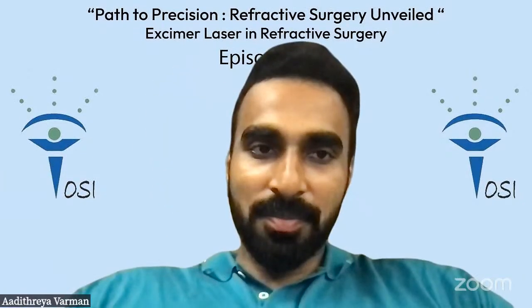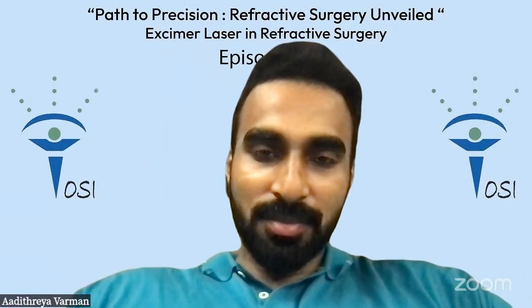Yeah. So before you answer, Aditya, as I said, the algorithm doesn't include not choosing a patient. It doesn't tell you to reject a patient. It just tells you whether to do a PRK or Smile Xtra or Phakic IOL. So not now, but as we move forward, I think it will be a part of our practice.